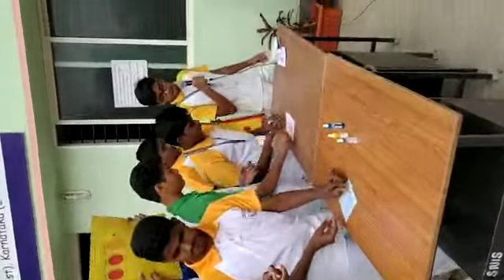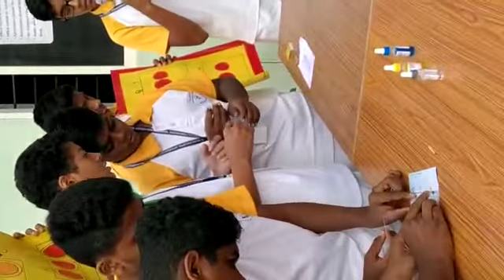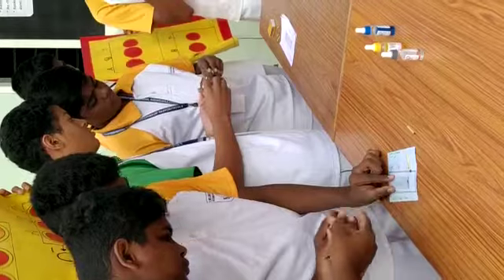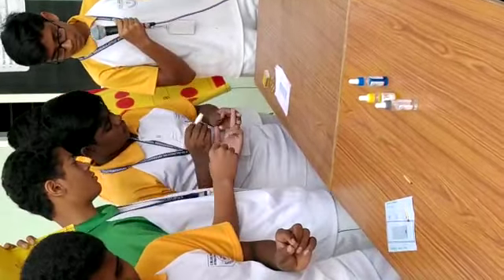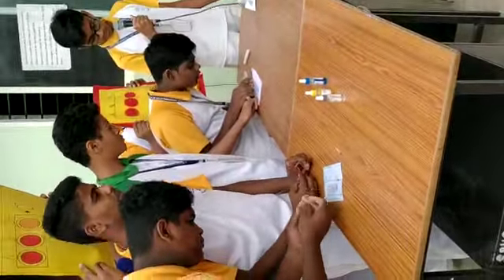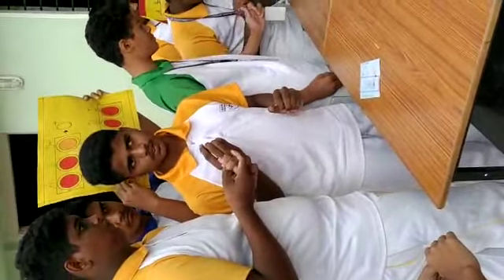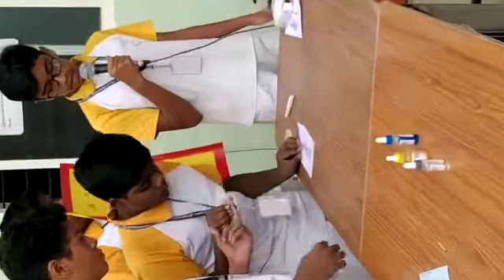Myself, I am Rishi. These are my friends Aditya and Sanjay. Aditya and Sanjay are performing a blood test activity to test the blood group of Aditya. Now Aditya is pricking his finger. Now Aditya is placing his first blood drop. He is placing the second drop of blood and finally the third drop.